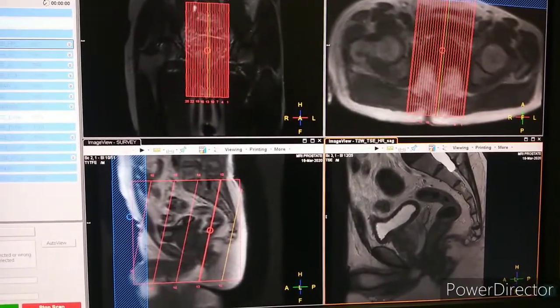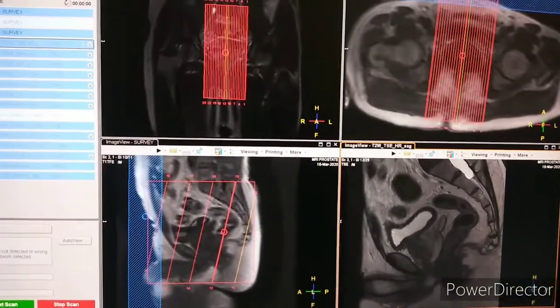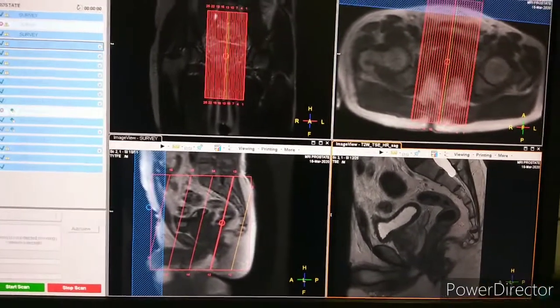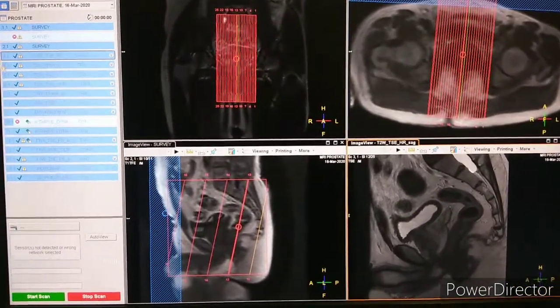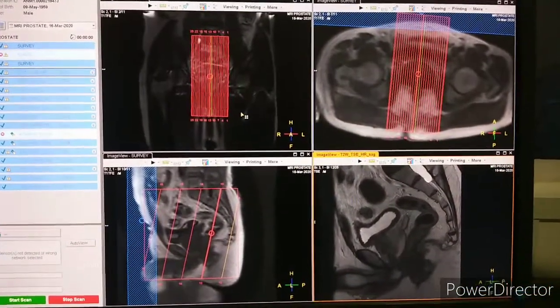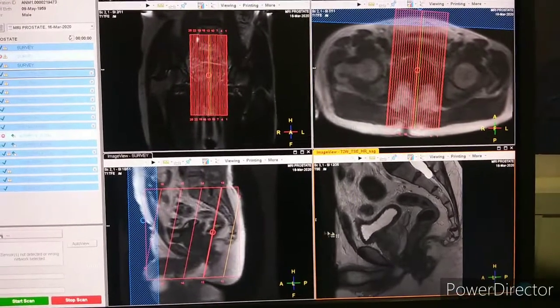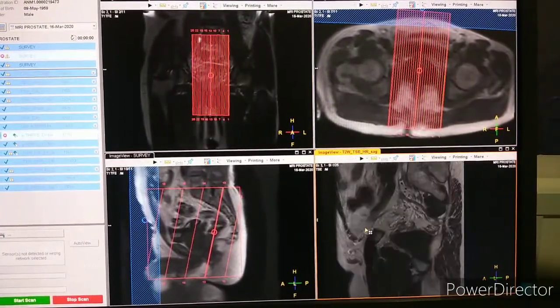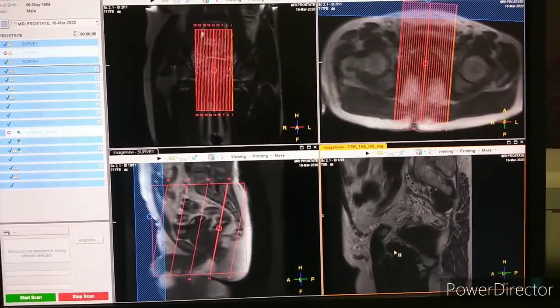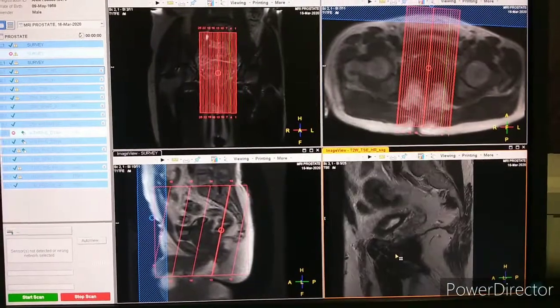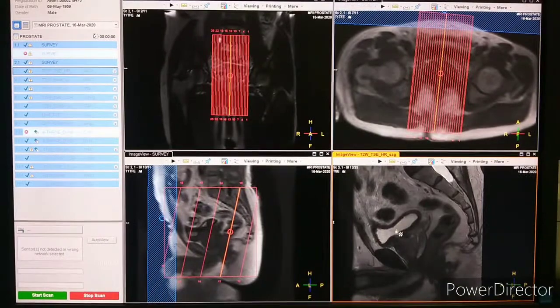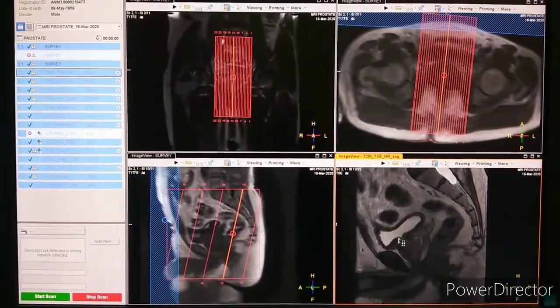We'll see the first planning of sagittal. Remember, we have to take the sagittal sequence first always in any pelvis, whether it is a female pelvis or male pelvis. This is the first sequence we have acquired, that is T2 weighted sagittal. You can see the planning on coronal, axial, and sagittal. I'm scrolling from left to right — this is the prostate, this is the urinary bladder, this is the rectum.